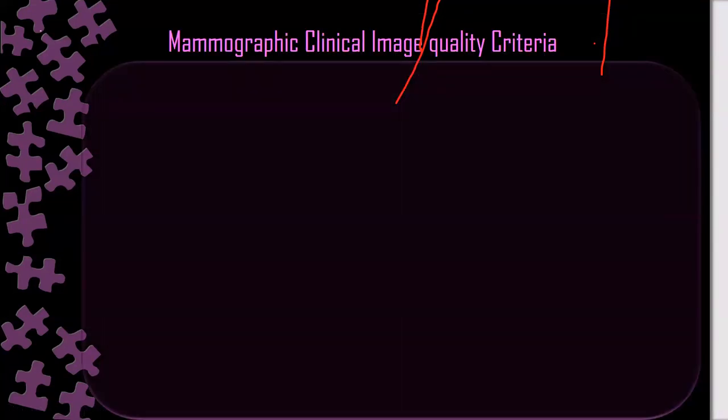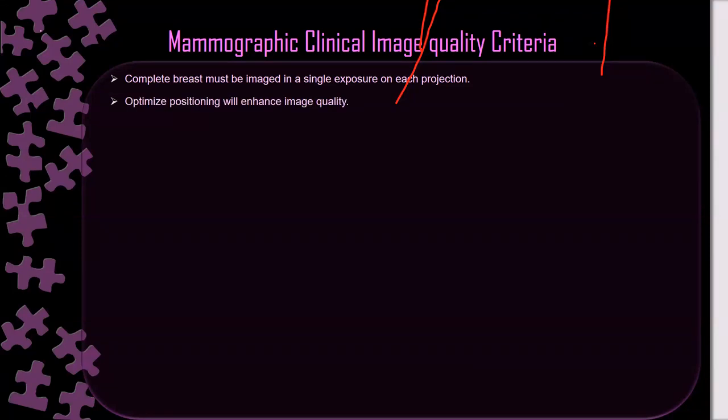So the mammographic clinical image quality criteria: it has to include the complete breast, must be imaged in a single exposure in each view, and to optimize.